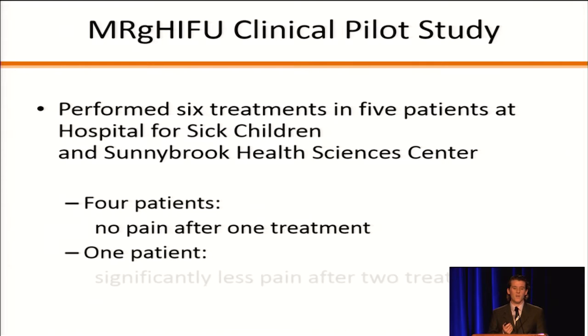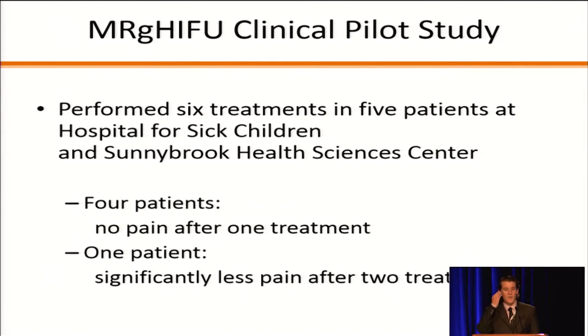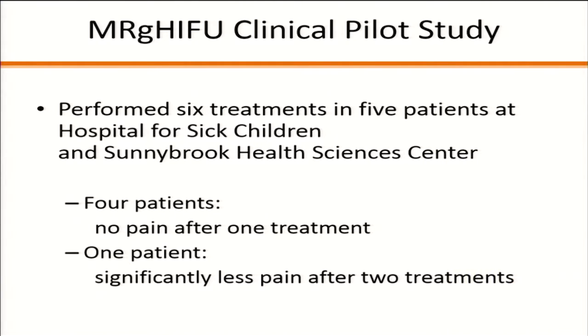An MRgHIFU clinical pilot study was conducted and performed on 6 treatments in 5 patients at the Hospital for Sick Children and the Sunnybrook Health Sciences Center. After treatment, 4 patients had no pain after just 1 treatment, but 1 patient had significantly reduced pain after 2 treatments.